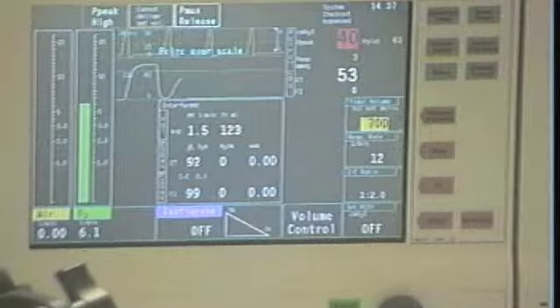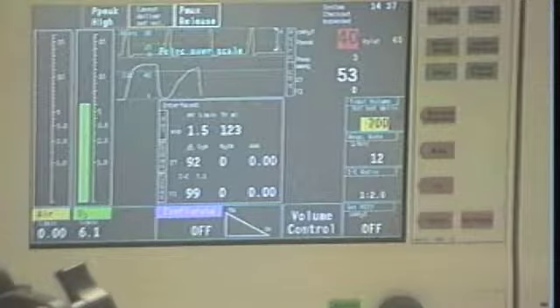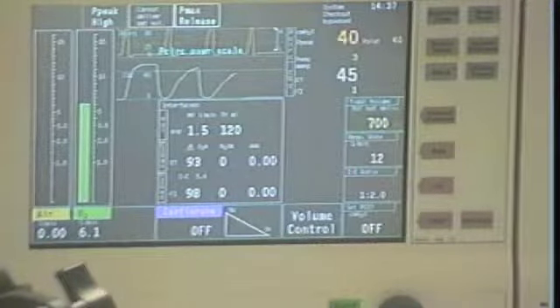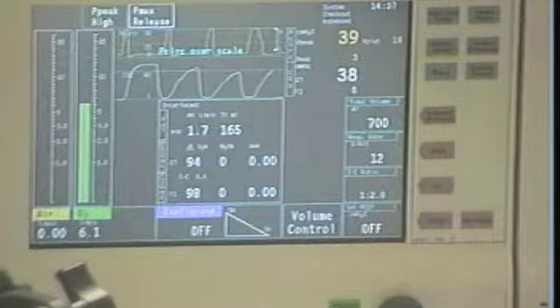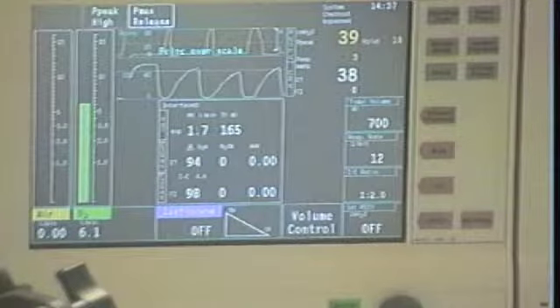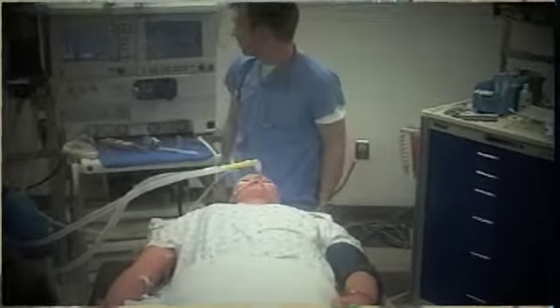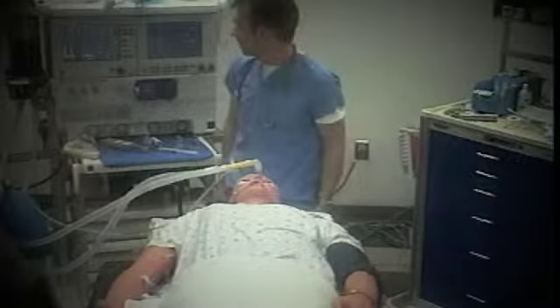As bronchospasm becomes more severe, you will see more pronounced signs of impaired ventilation. Some of the signs you may see include a decrease in your SpO2, your ventilator may start alarming for peak airway pressures, and you will have more difficulty delivering your tidal volumes. Your end-tidal CO2 will continue to climb. One must begin treatment to improve ventilatory status while ruling out other potential causes of impaired ventilation.